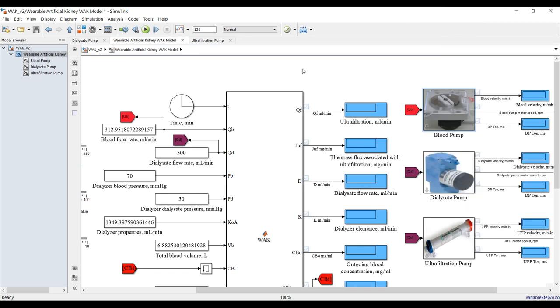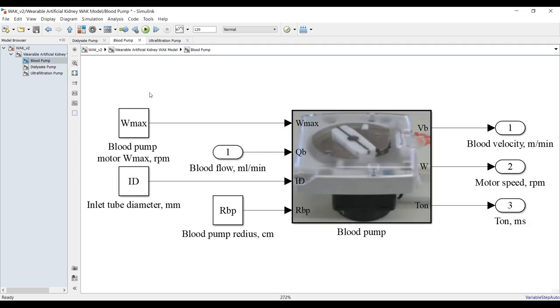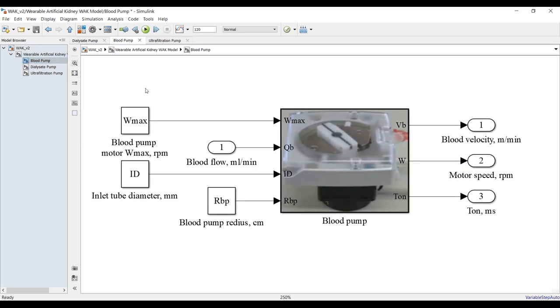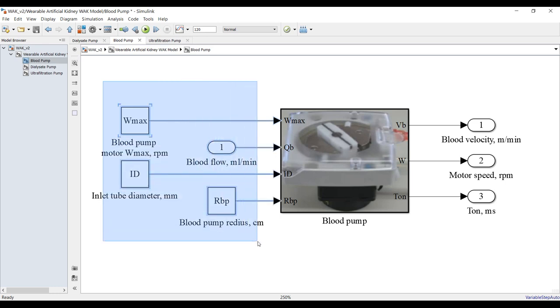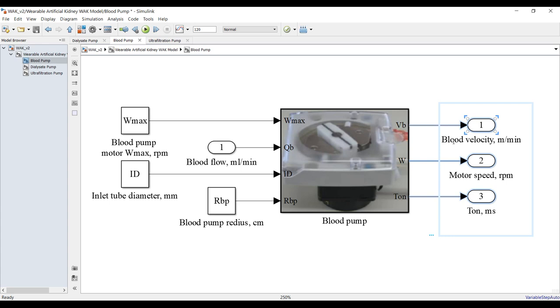You can go here with just one click and find your model. We need these inputs in order to get the outputs: blood velocity, motor speed, and flow rate. Let's go inside.